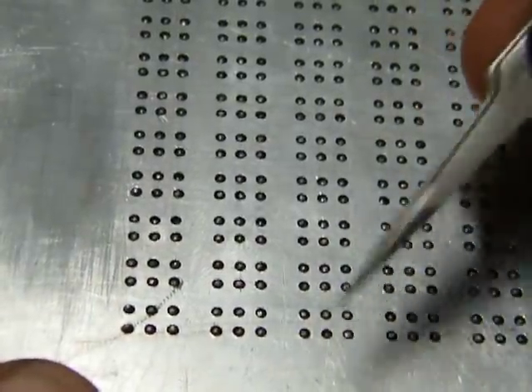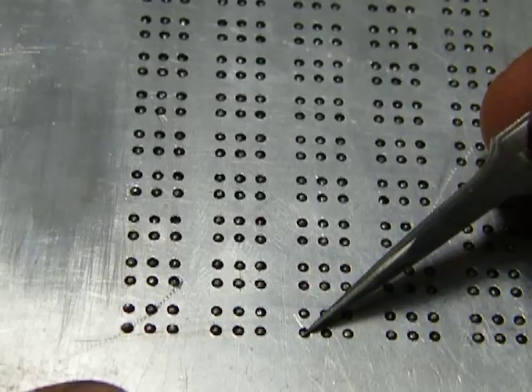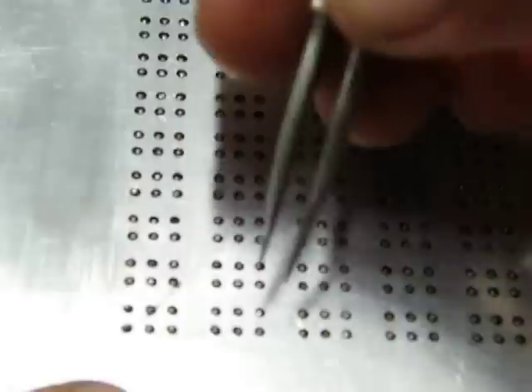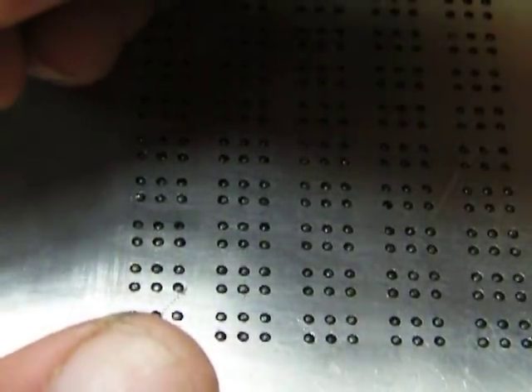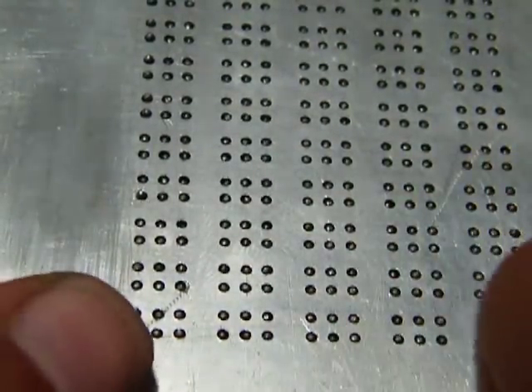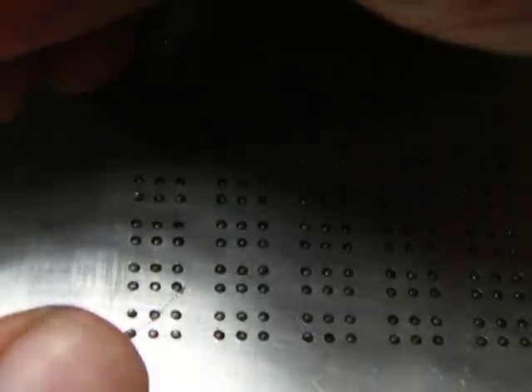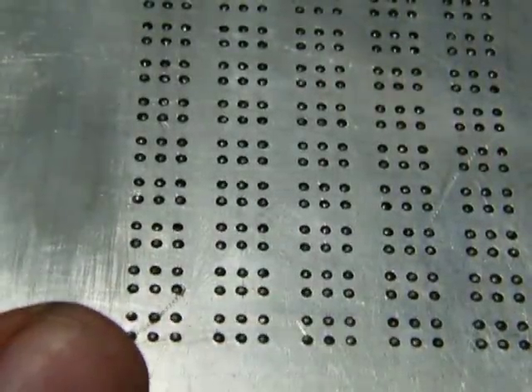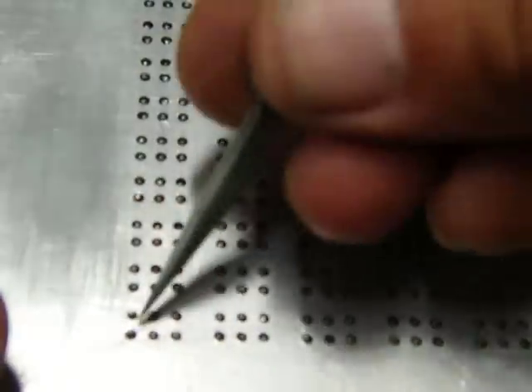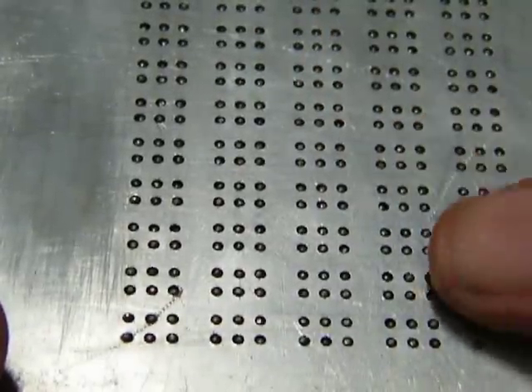Suppose I had to do it for cell 3 over here. I want A in cell 3. Cell 1 and cell 3 would need to be set simultaneously. So I'd enable column 1. I set row 1 of cell 1 and row 1 of cell 3 simultaneously. Latch again and release. Now we've got pin 1 in cell 1 and pin 1 in cell 3 set. So that's basically how you would do it.